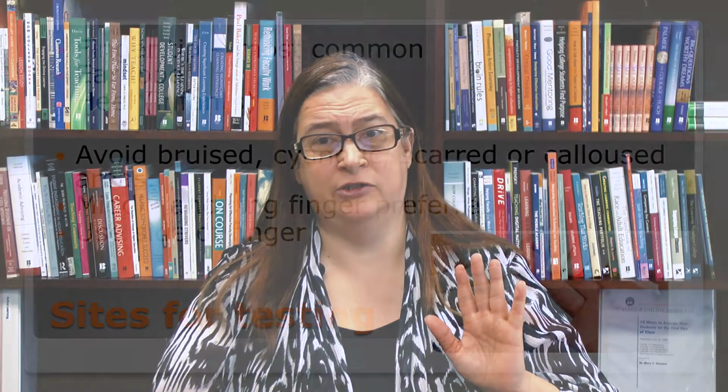However, I've had patients who insisted that you do it on the calloused area. Don't stand there and argue with them. The patient's always right. If they want you to do it, do it. It's just going to be harder. But that's not your gold standard area.